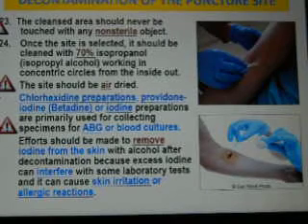That's when you're going to take out your alcohol prep pads. You're going to clean your area where your vein is. You're going to clean your index finger on your non-dominant hand, and while they're drying, you're going to get all your supplies together.